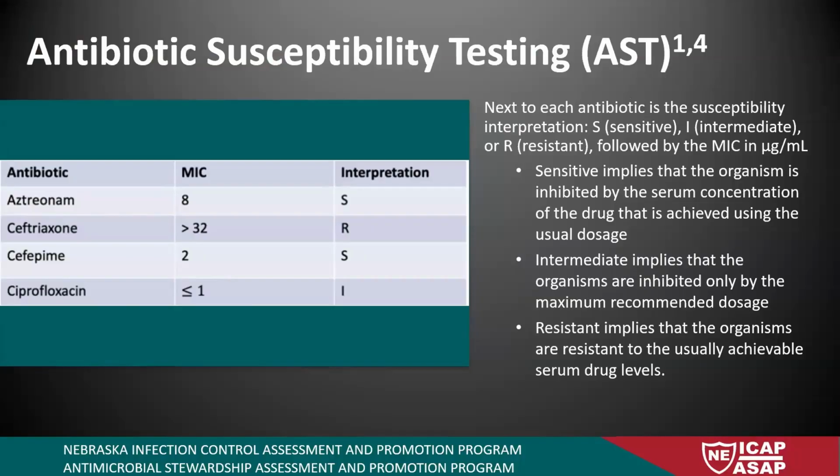Those are the ones I really want you to know how to identify in a lab report. Those are your carbapenemase producing organisms and Candida auris, or if you had some organism that was pan resistant to all antibiotics on a susceptibility panel, that would also be concerning. And you'd be like, yeah, we need to treat them as a tier 2 organism. Your tier 3s would be your ESBLs, your CREs that are not carbapenemase producers, or carbapenem resistant Pseudomonas. You would also want to use precautions for those.